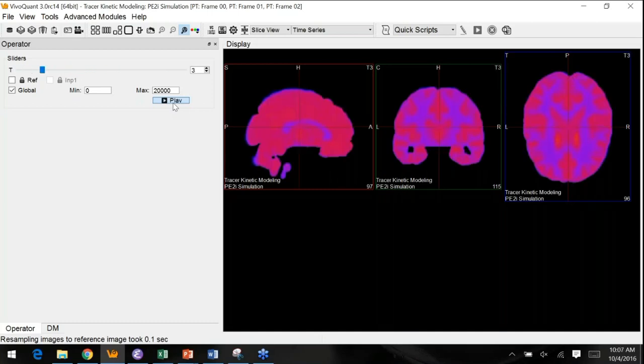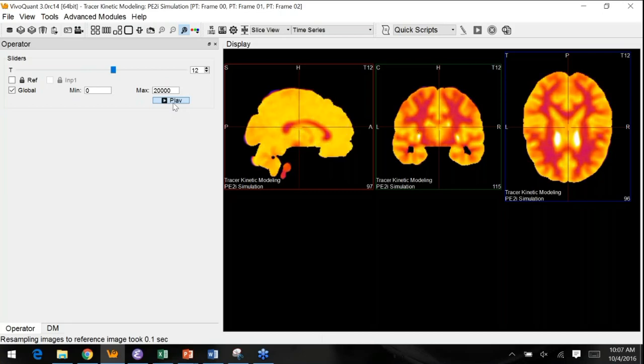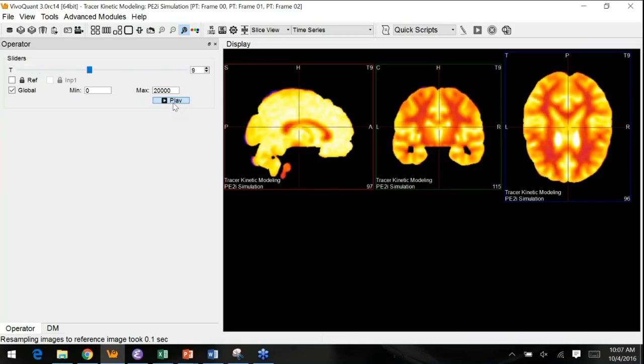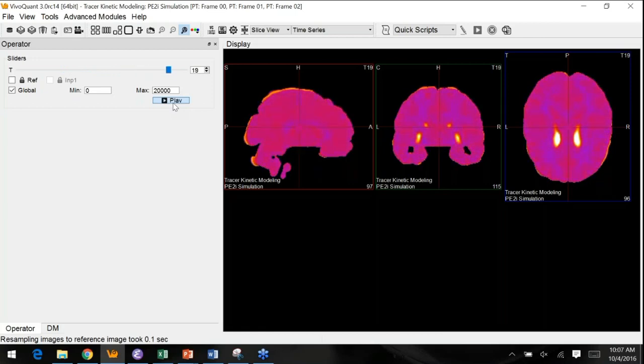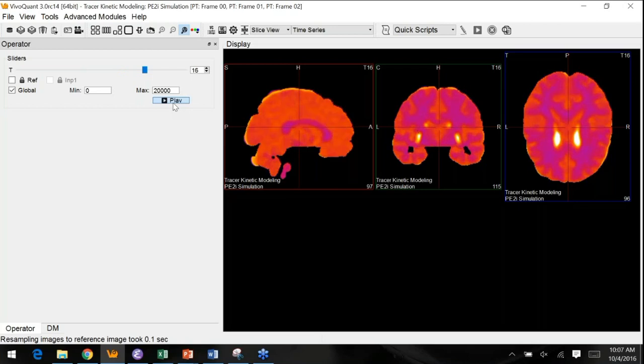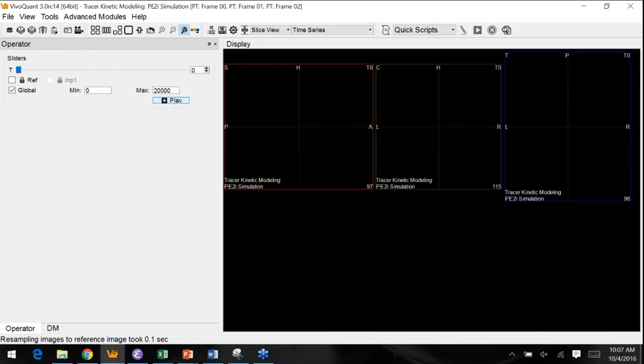The real reason I wanted to run this here was to show right away a lot going on in the striatum. Remember that for later on when we take a look at the curves. You'll see that the quantitative matches the qualitative, which is always what we want to see in imaging, right? And we can, of course, also save that movie directly to a GIF using our handy QC tools.